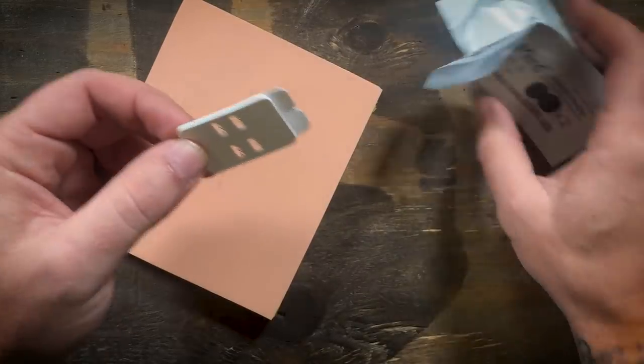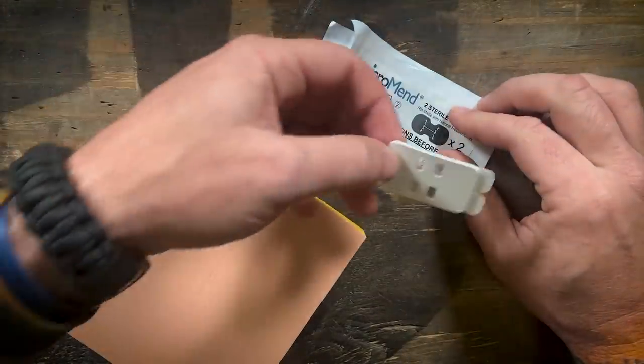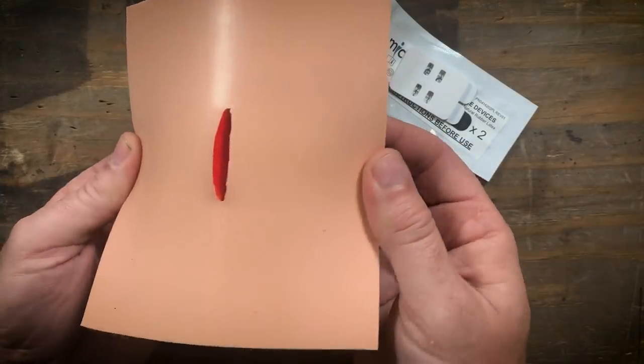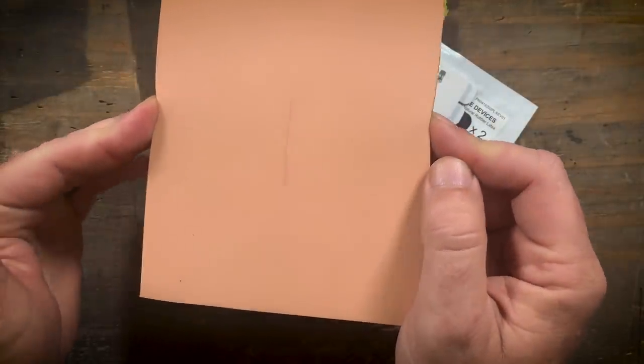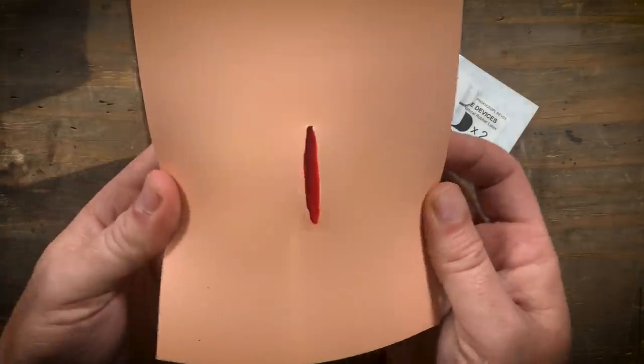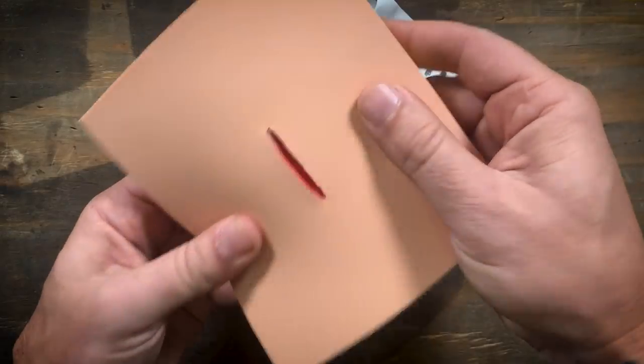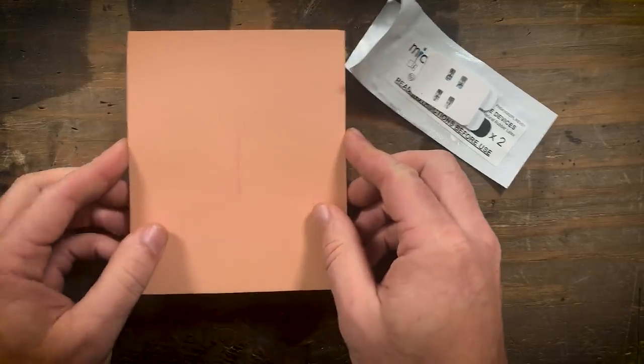So you got yourself a cut. I'm going to set this on the package. So you got yourself a good size cut right there and you want to close that up. Typically you might need stitches for something like this. So I'm going to show you how this works.